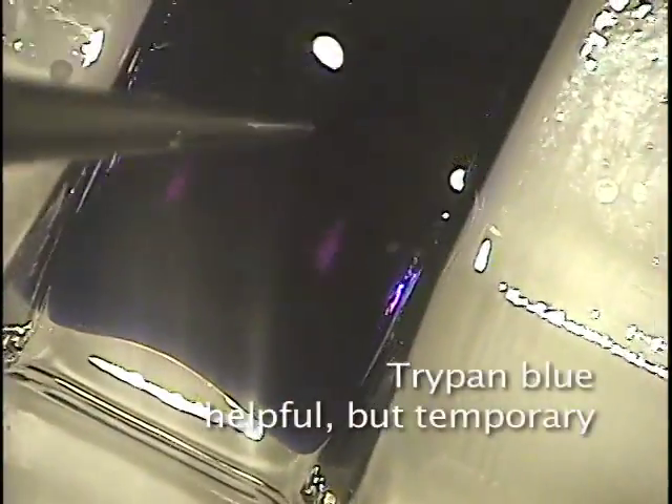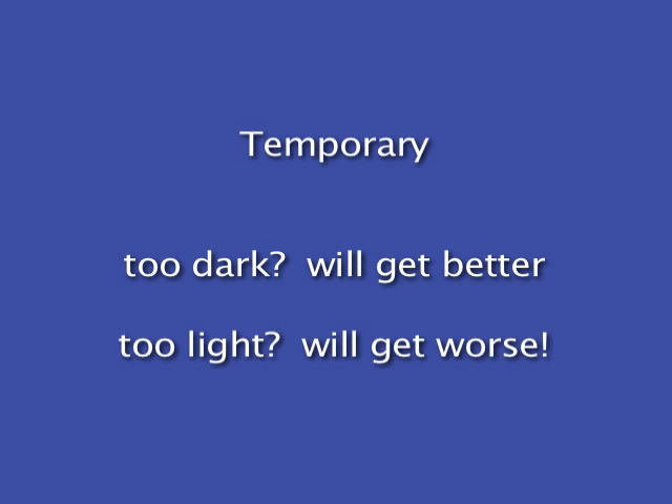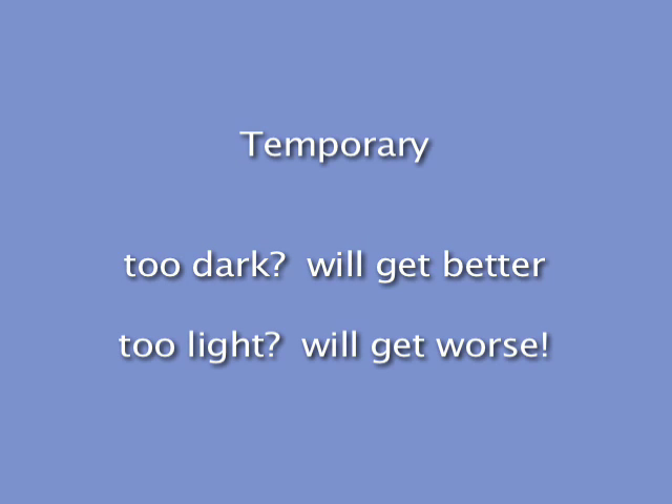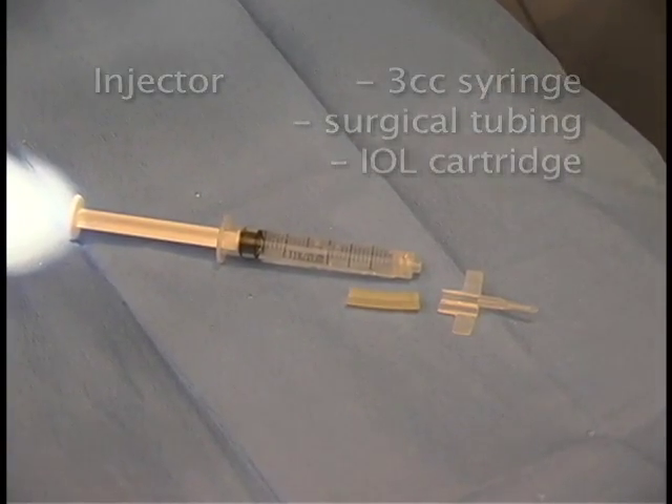We'll start with a fresh membrane harvested with a SCUBA technique and stained with Trypan Blue. The Trypan stain is temporary in the anterior chamber, so if it stains at first too darkly to tell which side is which, it will get better. If it stains too lightly to see, it will get worse.